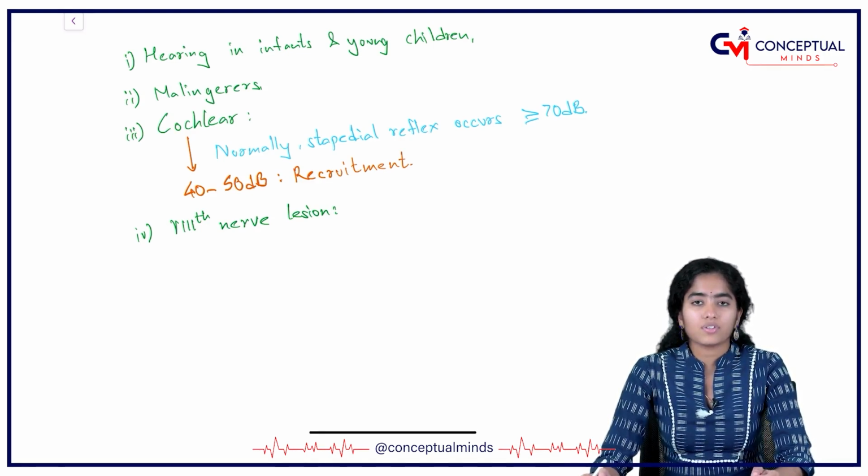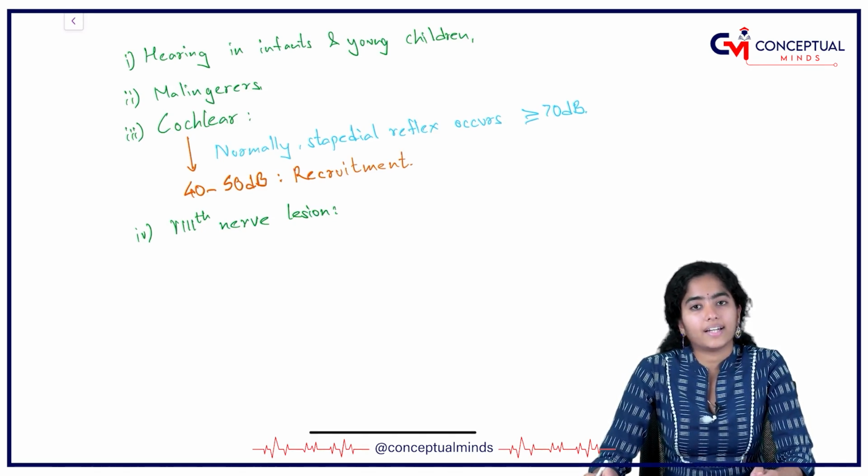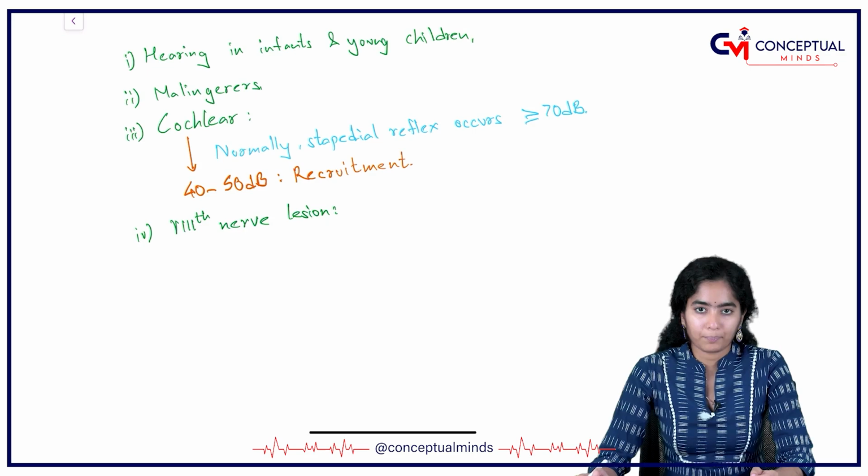That is, the eighth nerve is showing some abnormal adaptation, and that is indicative of some pathology in the eighth nerve.